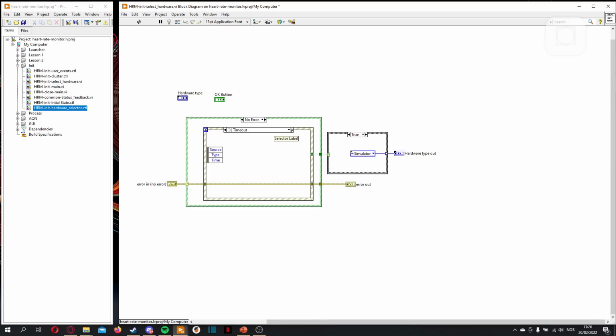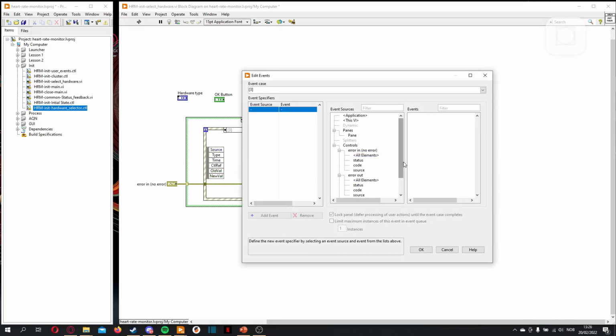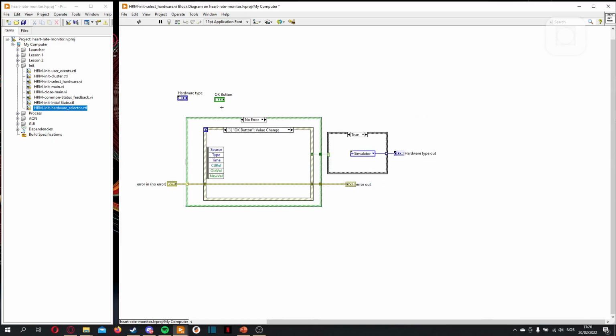And then lastly, we want our button here, the OK button. If it's an OK button, then it sends the true signal. I could map these to the actual buttons, etc., but I don't see any point in that. Might save me 1 second, but I have a second to spare.